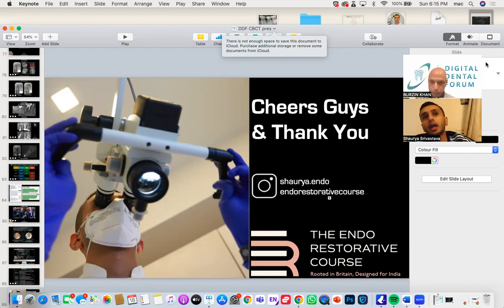The limitation of guided endo is that you need 3D printing, you need an intraoral scanner, and you need to superimpose the CBCT DICOM files with your STL files. To make a right guide design, you need the right burrs for it as well. So guided endo is definitely a great option, but you can't use it in all cases. I think the cost for every treatment is very high. But for calcified canals especially, they are known to be very predictable, about 91% accuracy in finding canals.